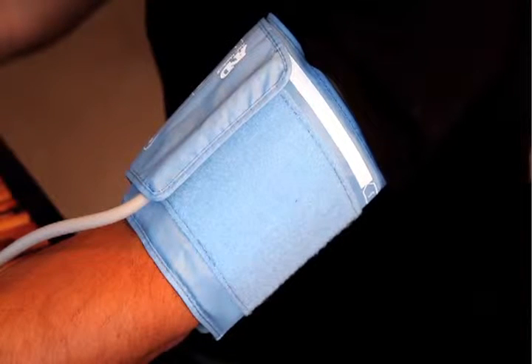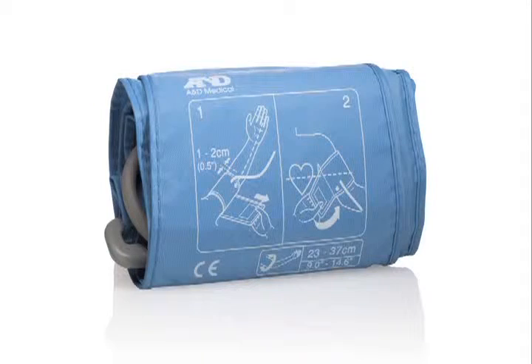Since the right cuff size is essential to obtaining accurate readings, our medium slim-fit cuff is designed to accommodate arm sizes from 9 to 14.6 inches.